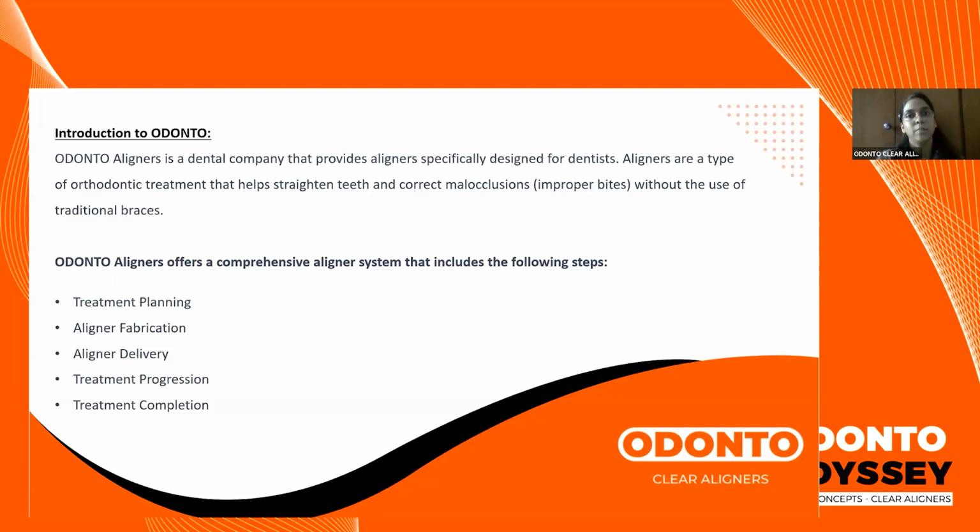The other part that we help with as planners is the type of retention which will be required after treatment is over. Sometimes you have cases of diastemas. They might require fixed retention in addition to your clear retainer, or any other retainer that is available. So in terms of deciding on that, and if there are missing teeth and you want to bring about correction but at the same time want us to create space for your patient.